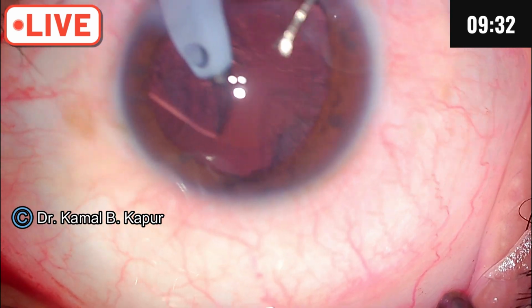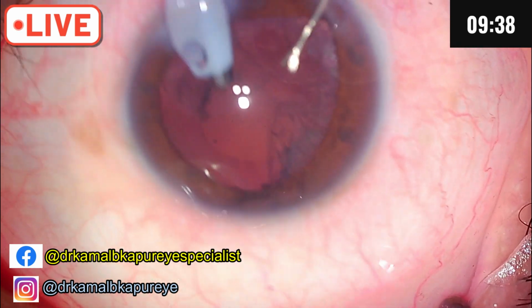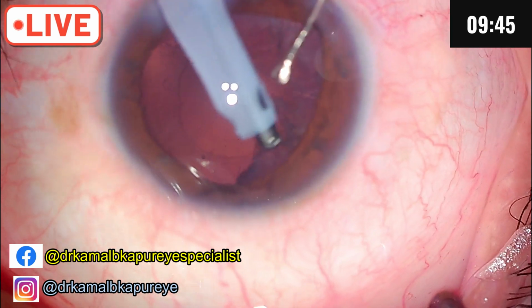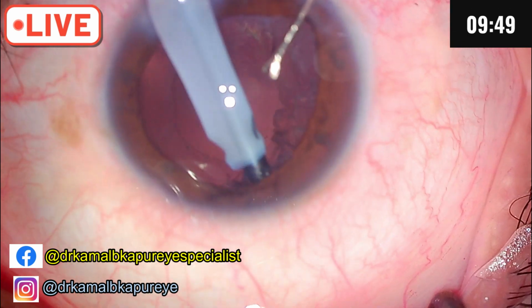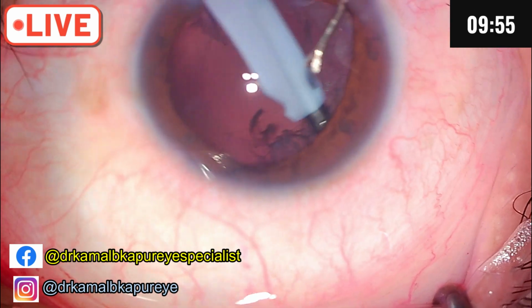Now this is usually a tricky part. You can use a bimanual IA if you are comfortable. I am comfortable with both, so I would sometimes use a bimanual, sometimes I get away with. Now, as I said, this is very, very tricky.